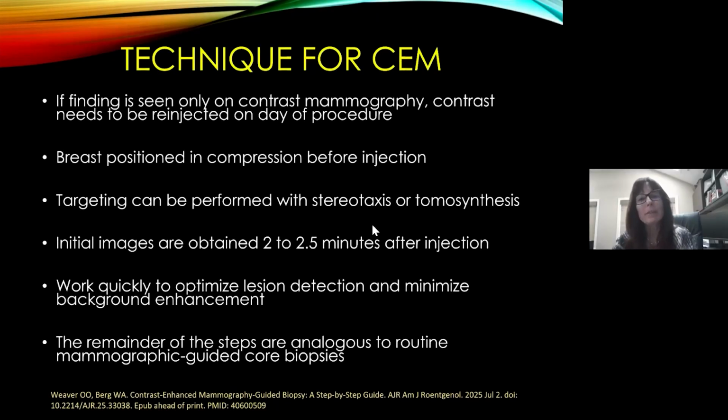So sometimes lesions are seen only on contrast imaging. At my facility, we do not do contrast enhanced mammography, so I used a resource to obtain some information to present here. Importantly, the breast would be positioned in compression before injection of contrast. You can target with stereotaxis or tomosynthesis with contrast enhanced biopsies.